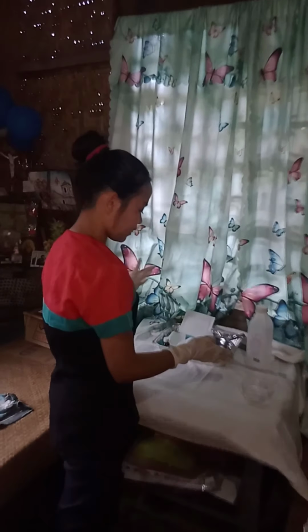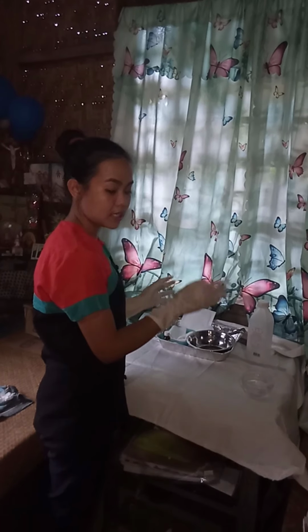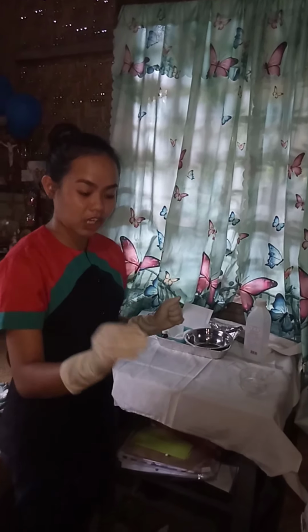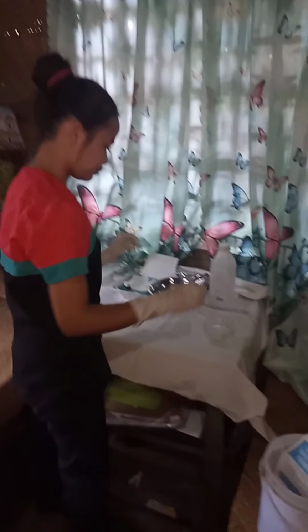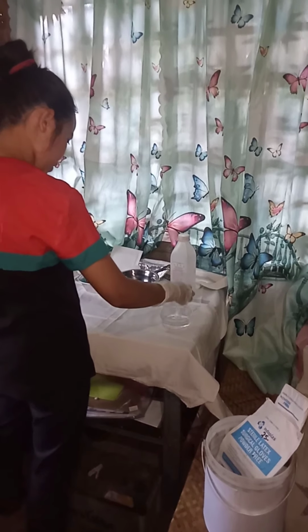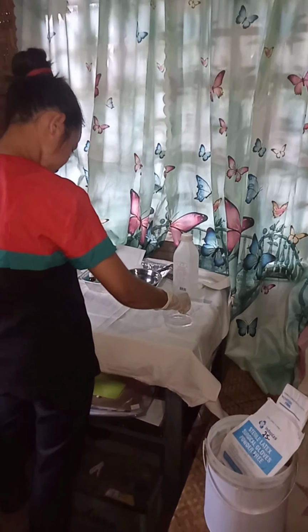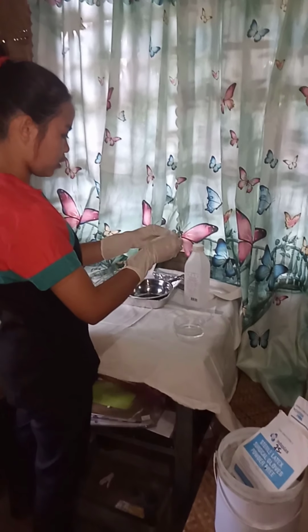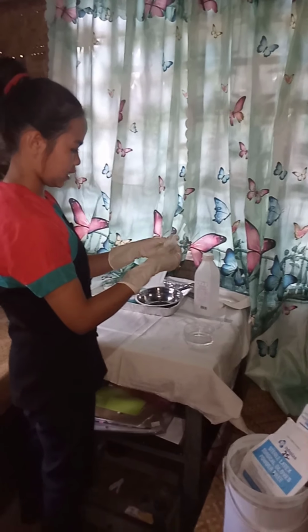Then after that, it is the time to apply this moist fine mesh gauze directly onto the wound as a contact layer. We need to squeeze it, then open it.